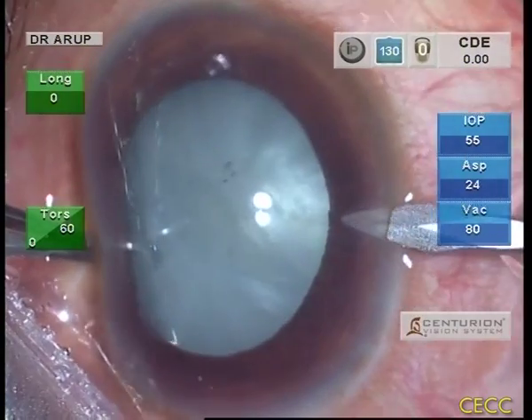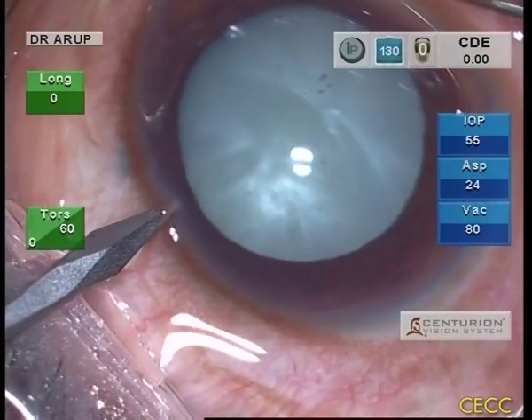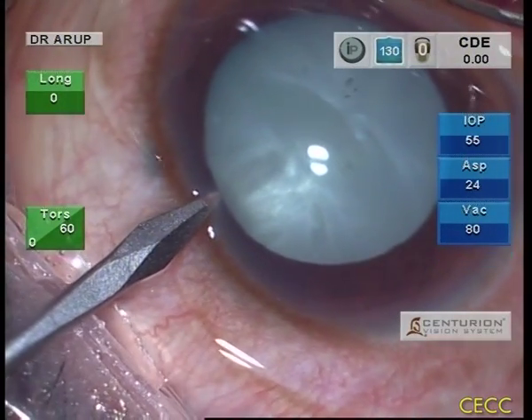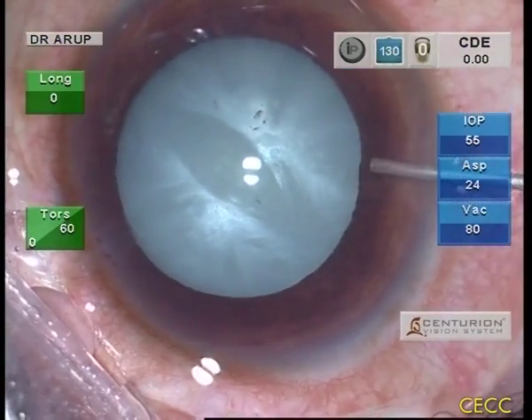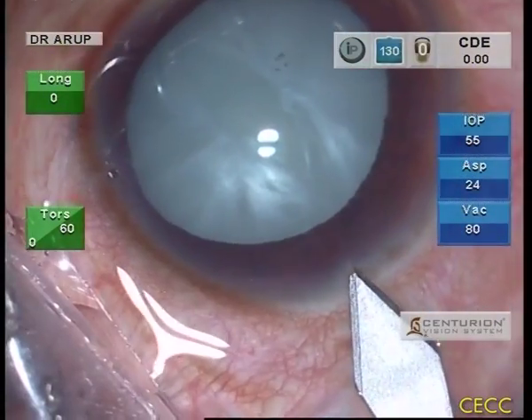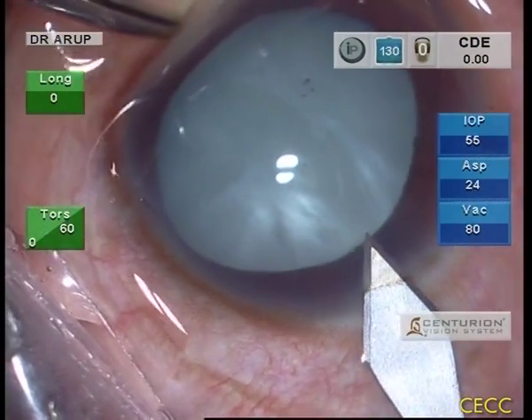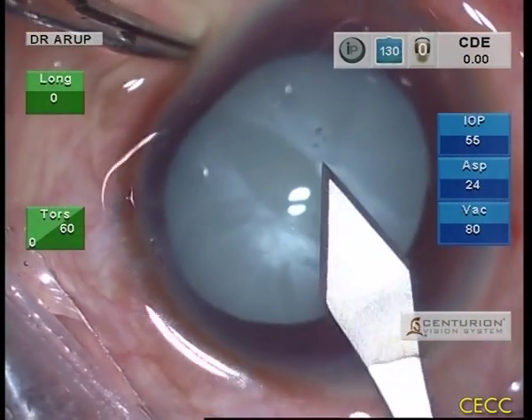Two paracentesis incisions were created with the MVR blade. BSS is injected into the anterior chamber to firm up the eye. Subsequently, the anterior chamber is entered with the keratome from the temporal approach, taking care not to traumatize the anterior capsule.